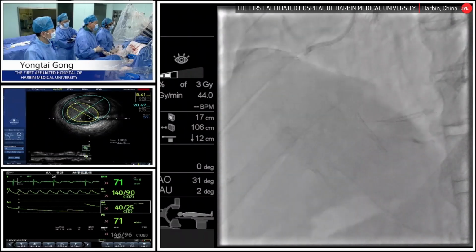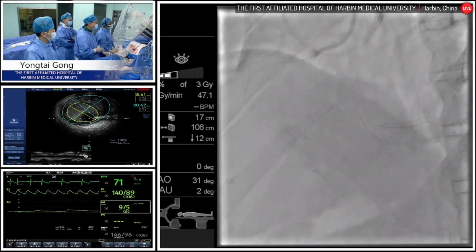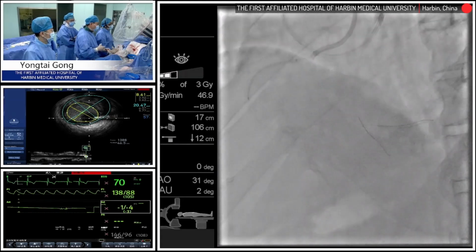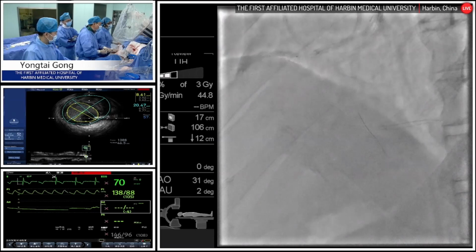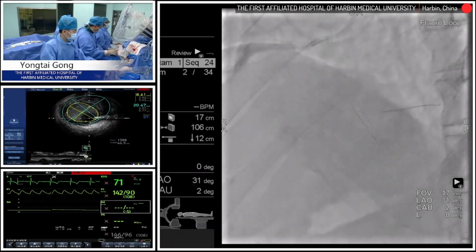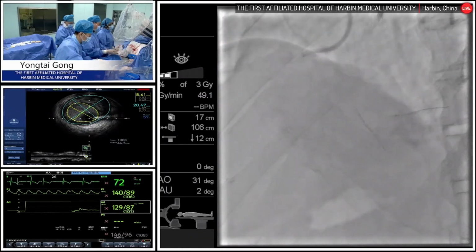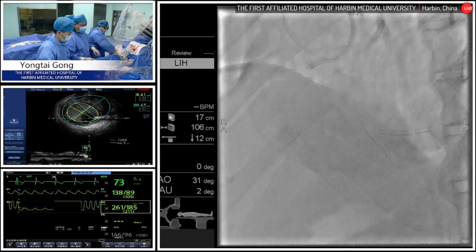And then, if the penetration with the Gaia family doesn't work very well, maybe potentially the CP12 and other very stiff wires are the only good choice. However, wire escalation is only one choice. Sometimes we need to switch to relatively softer and safer strategies, for example the Fielder XTR. It depends on the situation. Sometimes when it's very tortuous, with micro channels, relatively softer wires with good maneuverability and good response are a good choice.